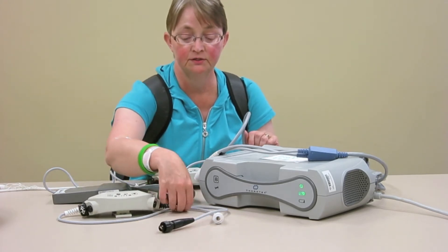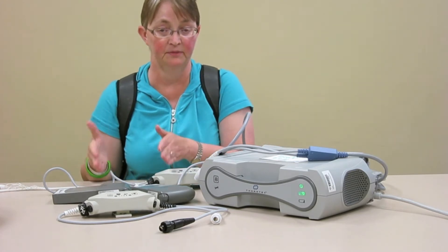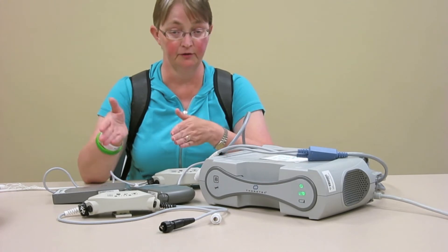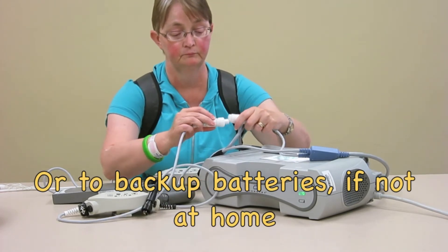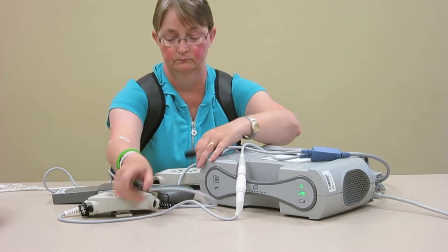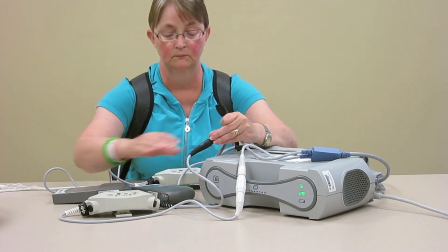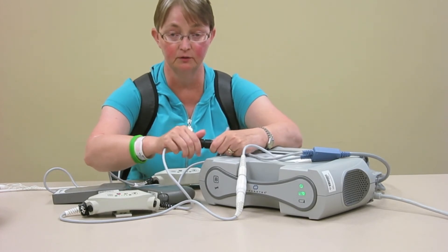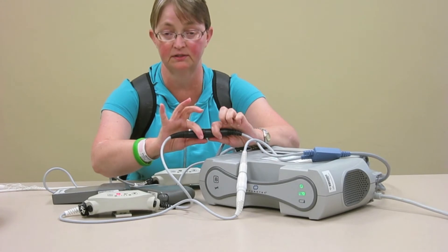The first thing you need to do is, whichever power source you are on — I'm going to do it from battery power — you need to hook the other controller up to your power module at home. The reason the alarm is going off is because I hooked it up to power but it's not hooked up to the pump, so it's letting me know that the pump is not attached to it.